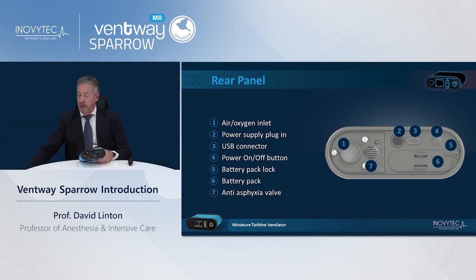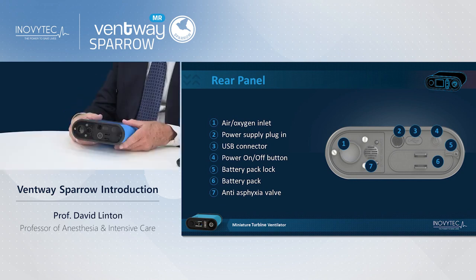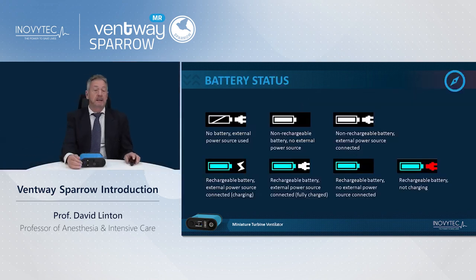And if you have a small bottle of oxygen with small flow, with this reservoir system, which I'll describe in another presentation, you can run the patient on oxygen without need of pressurized oxygen. The battery status is clearly identified on the graphic user interface.